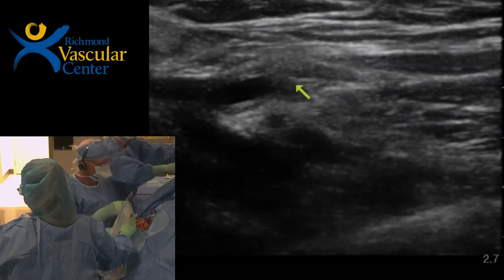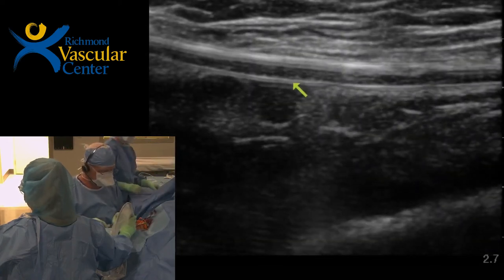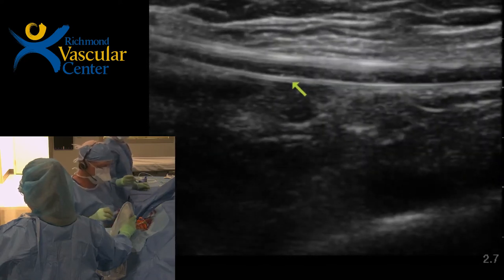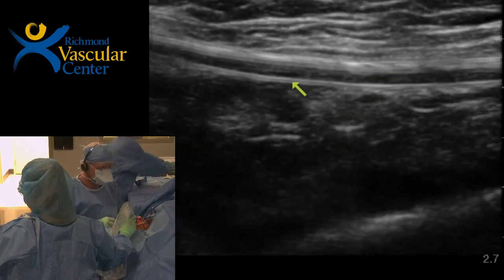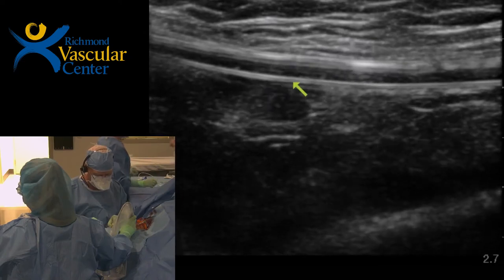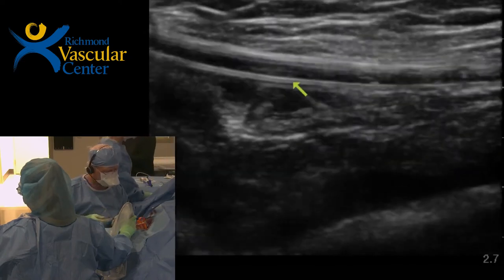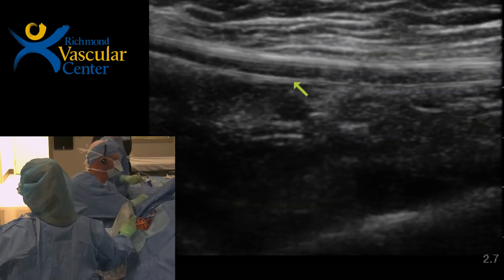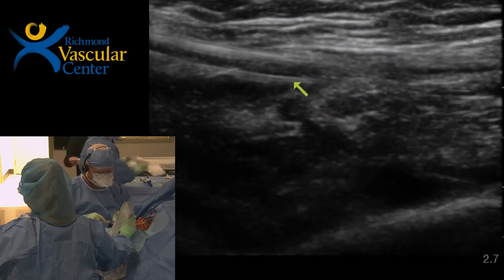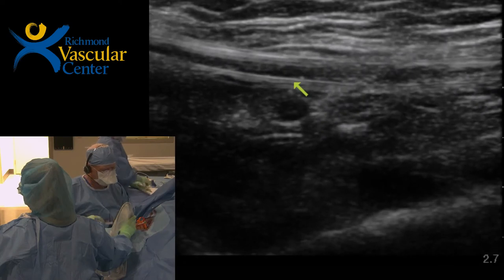So, of course, they're getting the catheter ready. So I'm going to flush it. I'll give a little heparin. Once again, since we're demonstrating, we're going to take our time. It's really kind of a homeopathic dose here, 3,000. Go ahead.